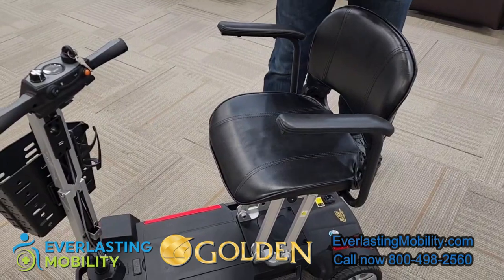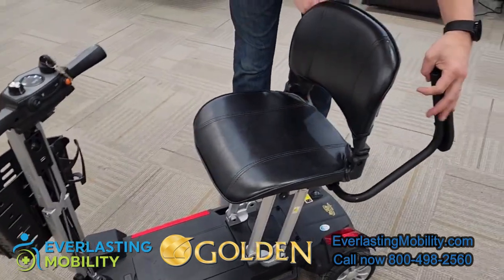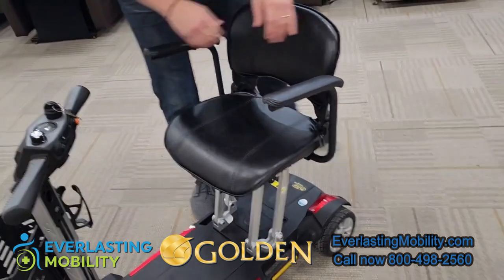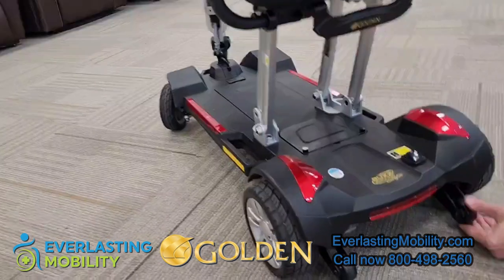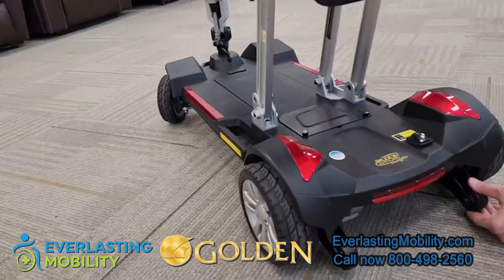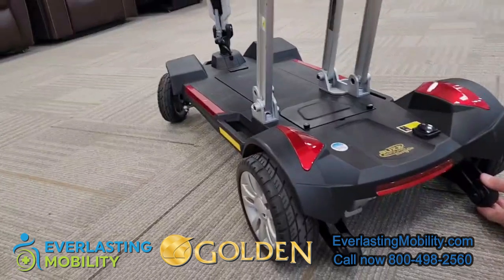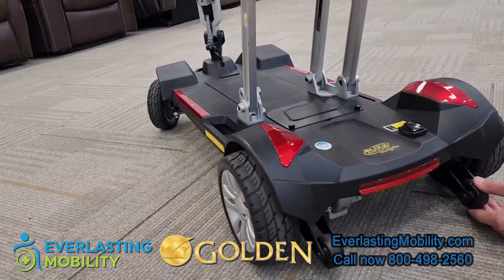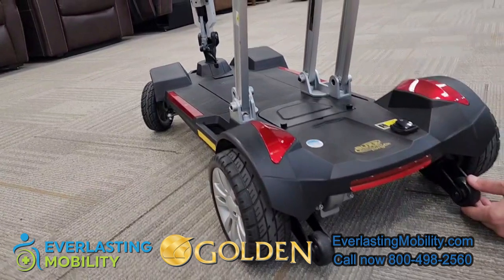It folds down really compact. The armrests on the scooter are adjustable so they fold back, making it easy to get in or out of the scooter chair. On the back of the scooter there are rear anti-tip wheels, which is a safety feature on most scooters — if you're going up a steep incline it ensures you do not tip backwards.